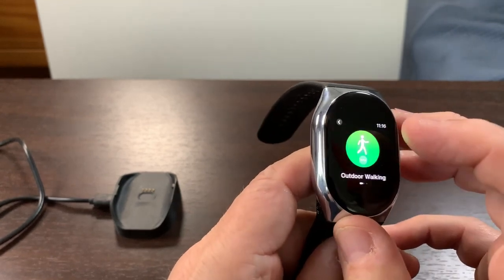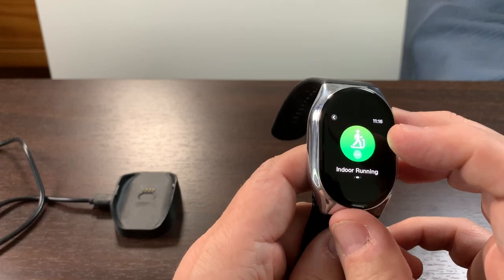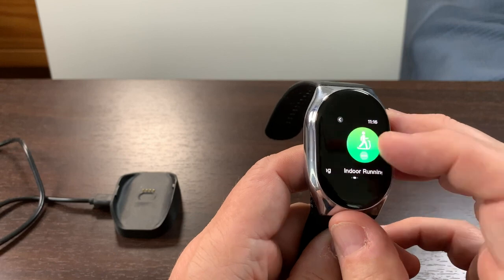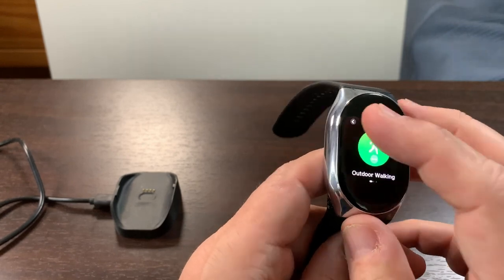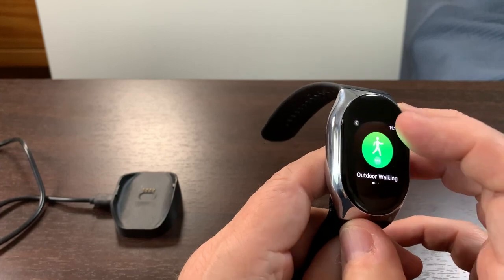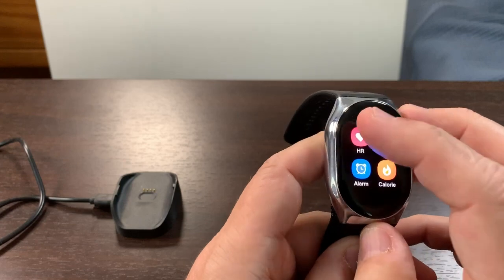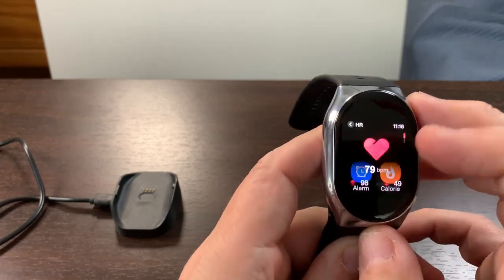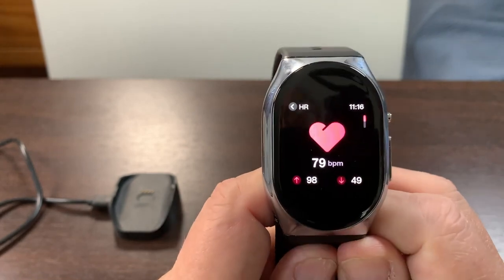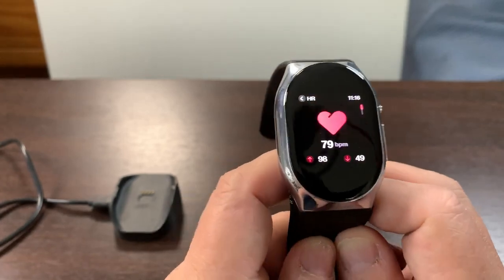It does have workouts, so you can have walking, treadmill, and outdoor running — those are the three I highlighted on mine. There are more exercises available, but you kind of tailor the watch to what you want to do. You can check your heart rate and see the high and low of a given day. It really is a good watch.